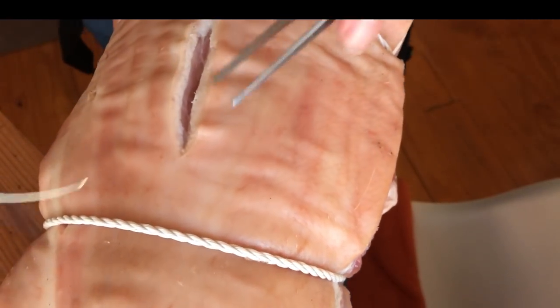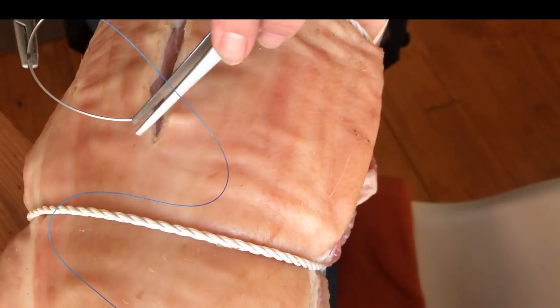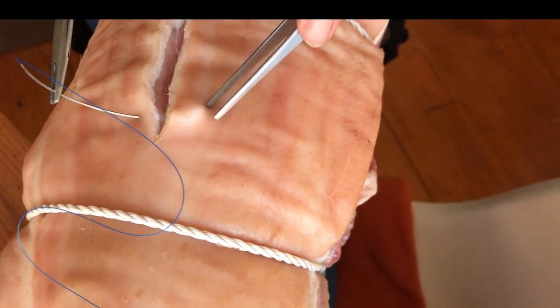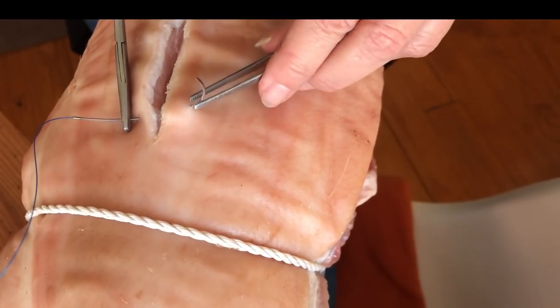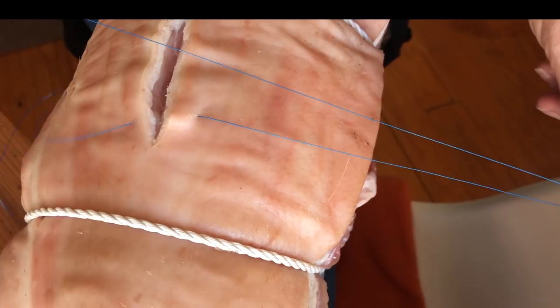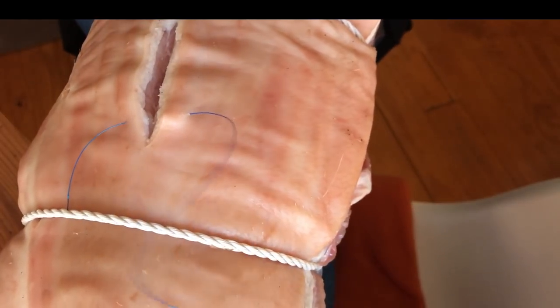Remember, the boat is moving around, everything's moving around, so I think this is going to work great. So what you need to do is put it in here on the one side, and they say that distance should be the same as the distance going down, and then coming up on the other side, their distance there and their distance there needs to be the same. Push it through and pull it, and then you pull it until there's only about 3 centimeters left on the other side. Okay, that is step number one.